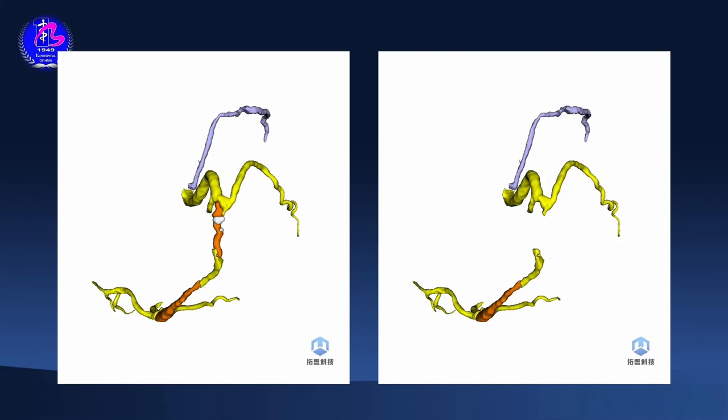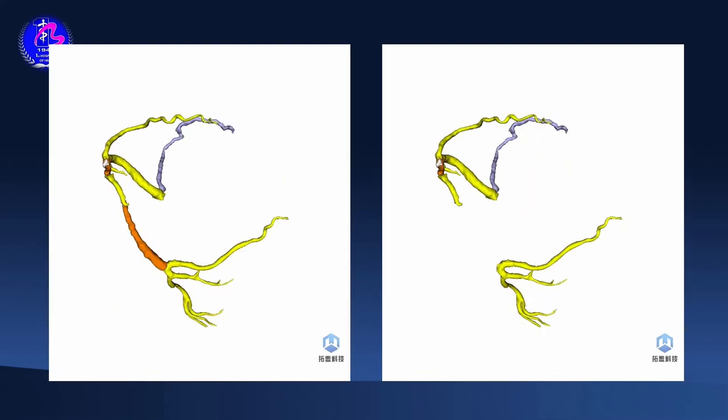And another very interesting point is where is the proximal cap of the CTO lesion? We could delete the first occluded segment, the brown one, to see where the side branch is and where the proximal cap should be. Certainly we will use IVUS to check the entry point. And really, there is a very long second occluded segment.